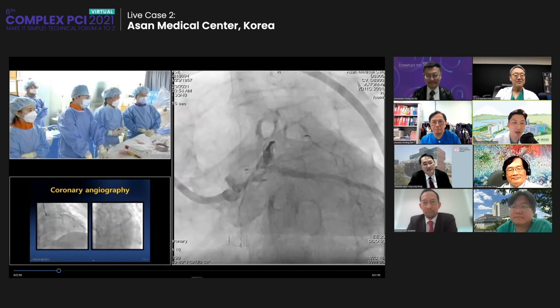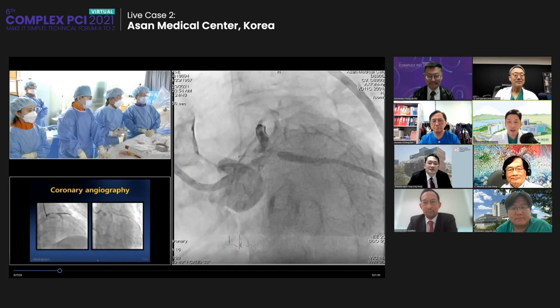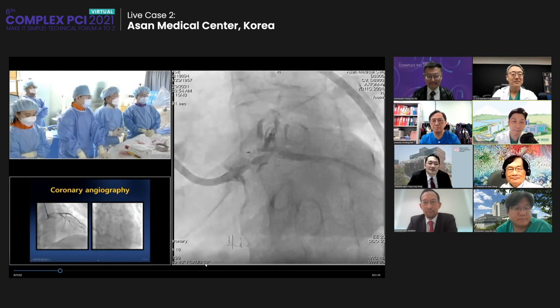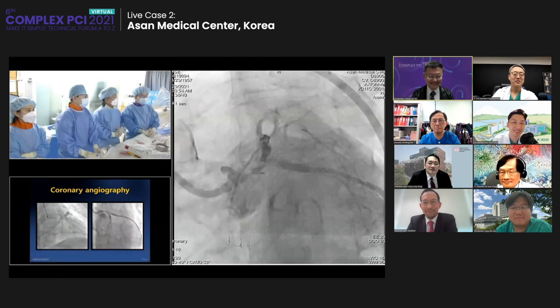Bifurcation. How would I treat it with PCI? Dr. Wan, what would you do? What did you do? This is a short time.